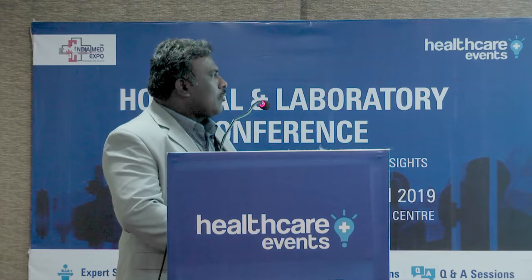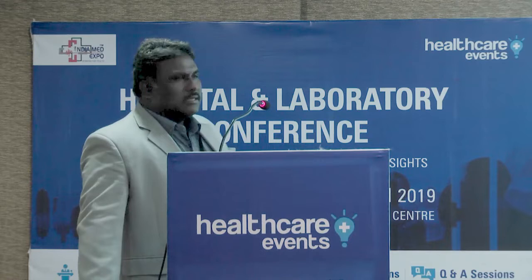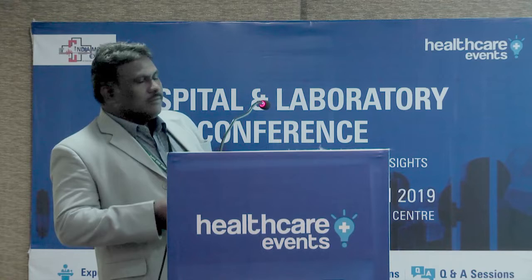How does it get transmitted basically? One more important piece of evidence: out of all these HAIs, 22% are caused by improper cleaning and sterilization, the process nothing but reprocessing. Any improper sterilization, I can say the reprocessing technique, will lead to a rise in healthcare acquired infections.